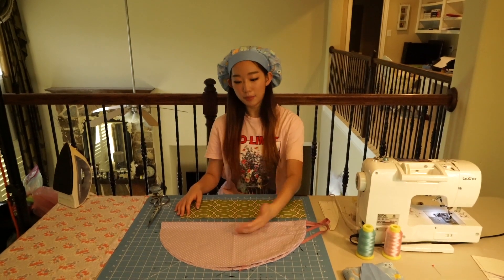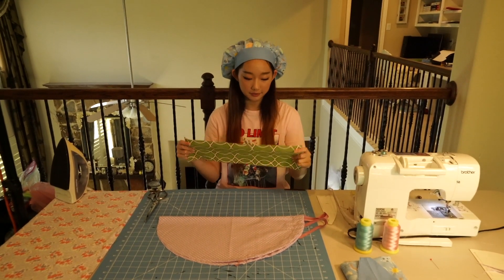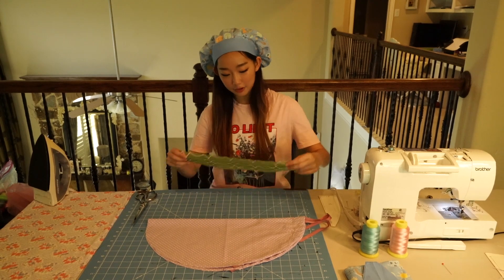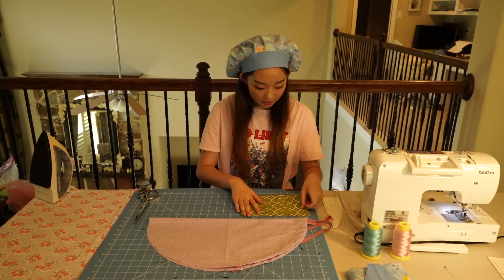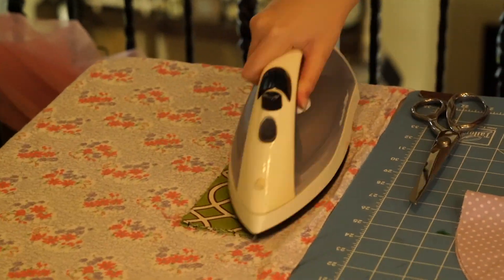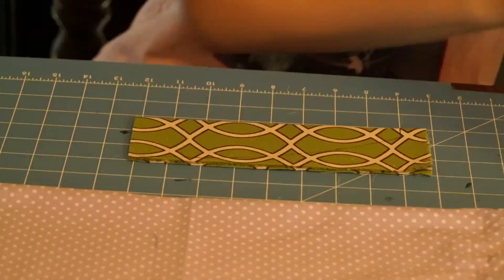Now we're going to make the front part of the cap with the pleats and the band. For the band, I cut a piece of fabric roughly six inches by 18 inches — this doesn't matter too much. After cutting that, fold it in half and then in half again. Put the pattern on top, trace it, cut it, and you'll get the shape of the band.